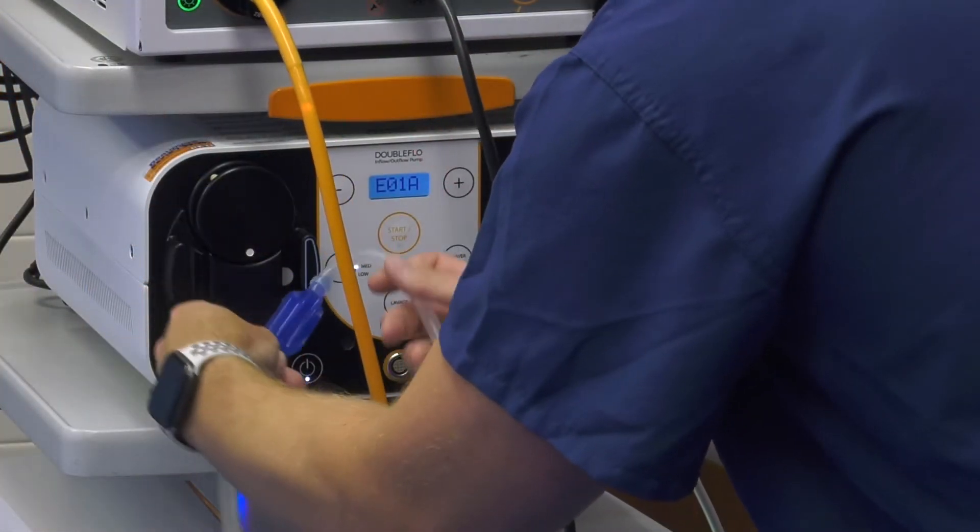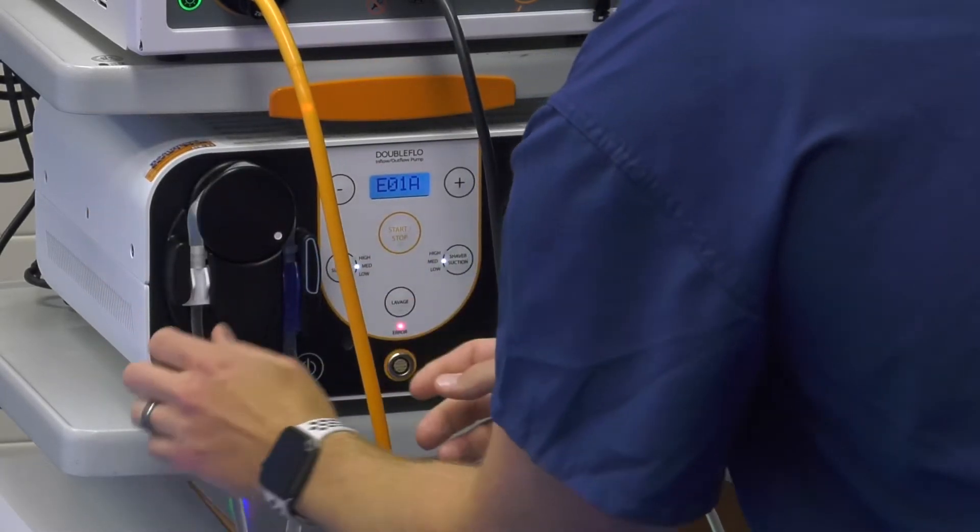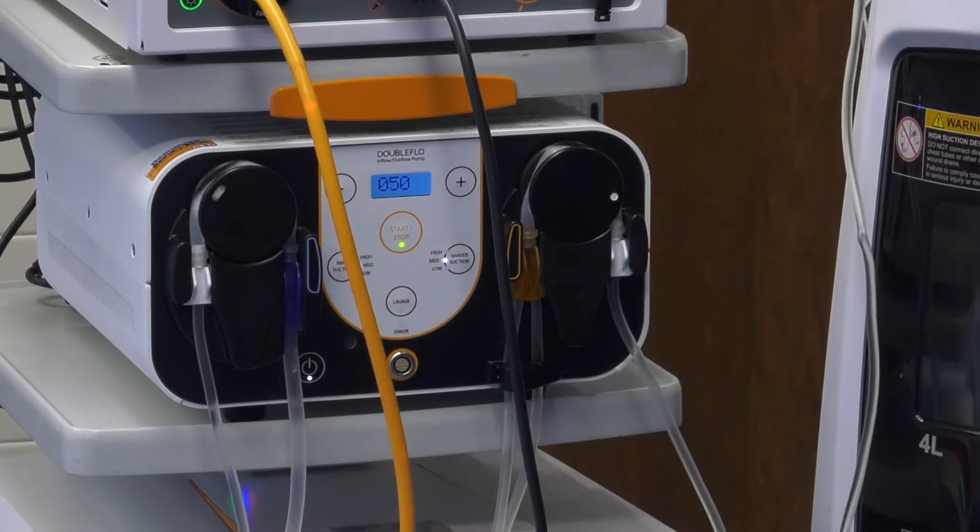A pump's responsiveness is very important to a change in fluid volume because that can either make or break the case. As you are doing the procedure, if when you turn on the shaver the shaver doesn't respond the instant the pump goes on, then you can have a difference in the flow and also visualization. The other option is going to be with the suction part — if too much suction occurs during the procedure, then you can get a red out and you won't be able to see the visualization in order to perform the procedure.